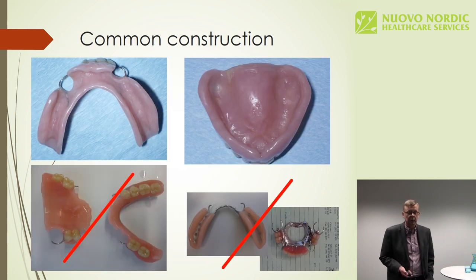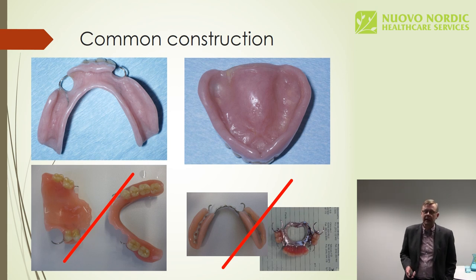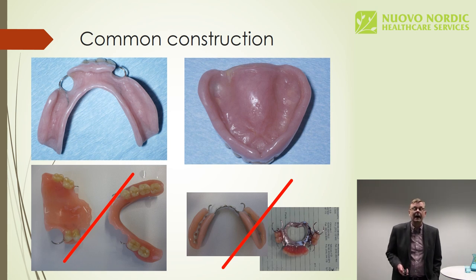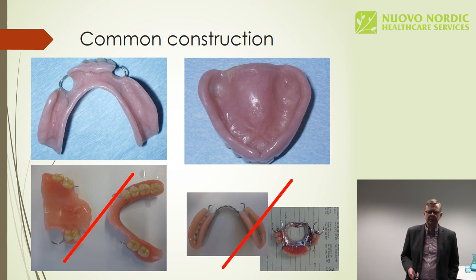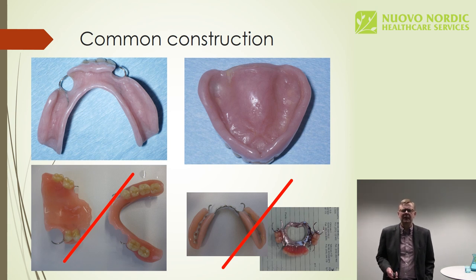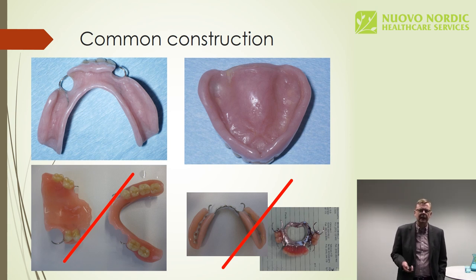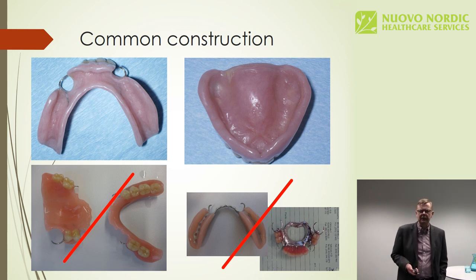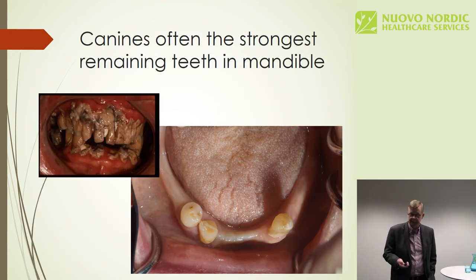So today we'll talk about the fabrication of a complete denture for the maxilla and an acrylic-based partial denture for the mandible. We are not dealing with dentures with a metal frame because the fabrication process is a bit more complicated. And on the other hand, in Namibia, I have a feeling you have much more use for partial dentures with an acrylic base, as we see.